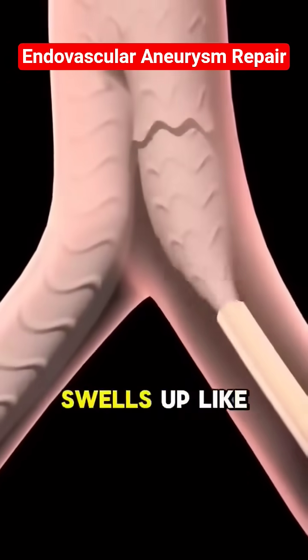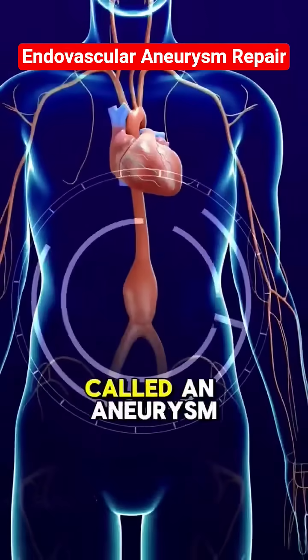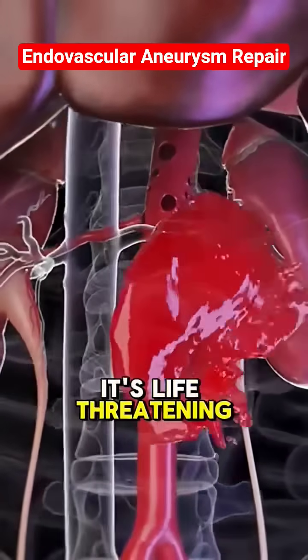When the main artery, the aorta, swells up like a balloon, it's called an aneurysm. If it bursts, it's life-threatening.